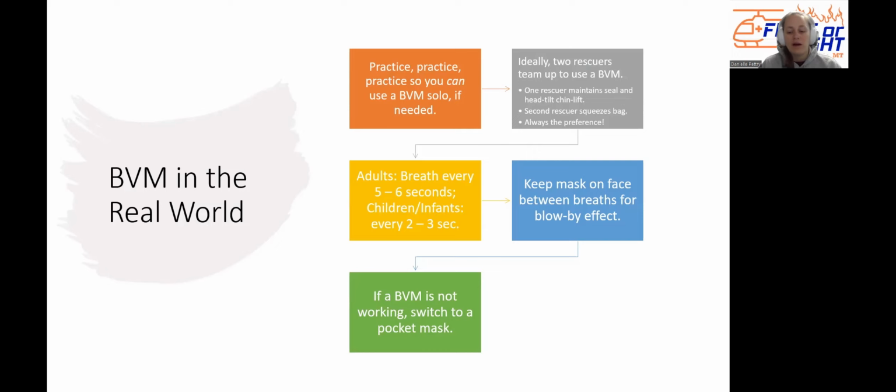One example, if you have seen my continuing education class, or if you're going to do that on cardiac, the cardiology, the add-on to CPR event where we talk about pit crew CPR. One of the things that's recommended in one of the CPR pit crew things that I like the best is that the person who's running the AED, they actually help give the breaths on the BVM. So if you have 3 rescuers, one's doing compressions, one's doing breaths, and the third one is doing the AED. The person who's on the AED is waiting for the breaths, but the person who's giving the breaths, they're actually using both hands on the mask with the head tilt chin lift the whole time.